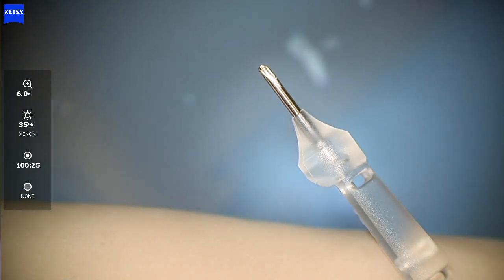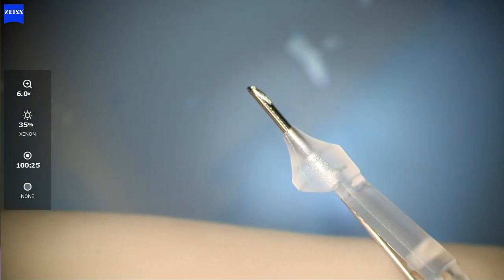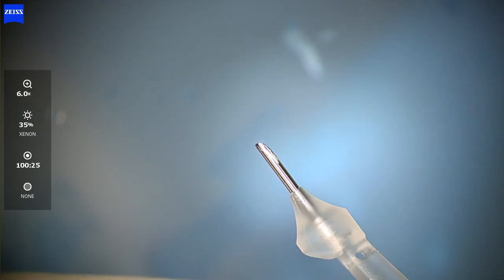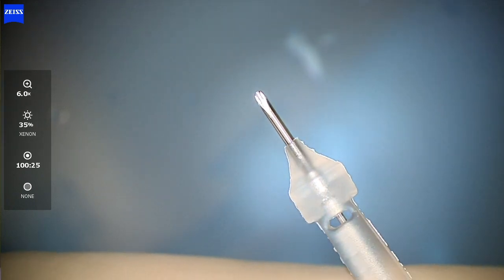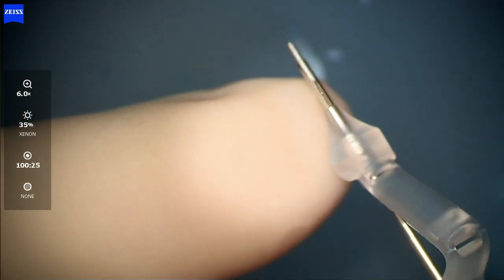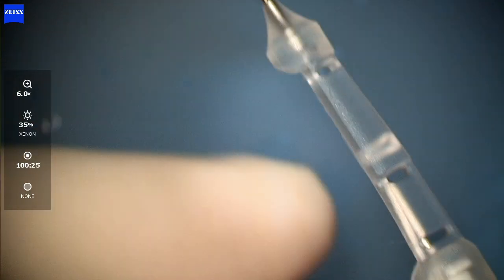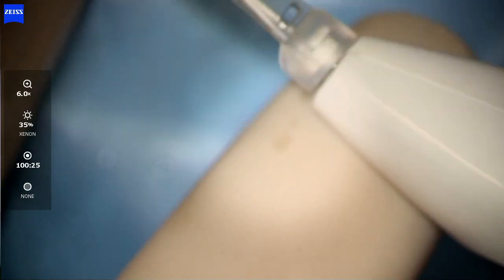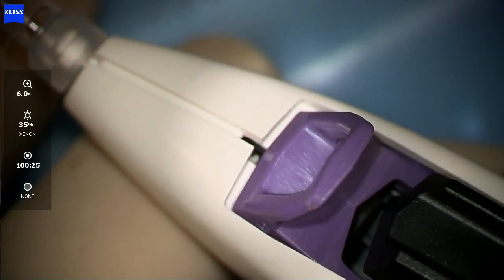This is the i-Stent Infinite, which has three i-Stent injects in a single loader. The tip of the introducer protects the trocar and allows entry into the anterior chamber. It has an auto-retracting tip, so as you enter through the clear corneal wound into the anterior chamber, that rubbery material automatically retracts back and also blocks egress of viscoelastics to keep the chamber more stable.